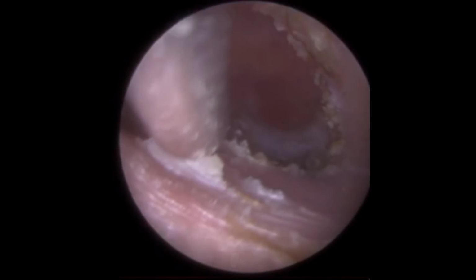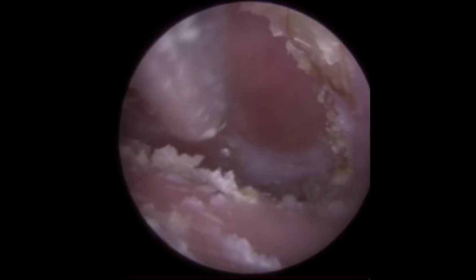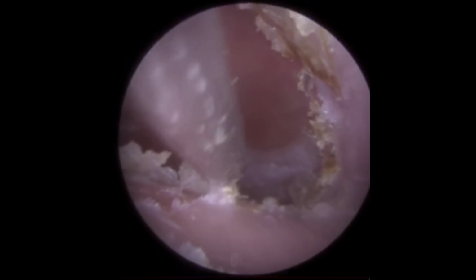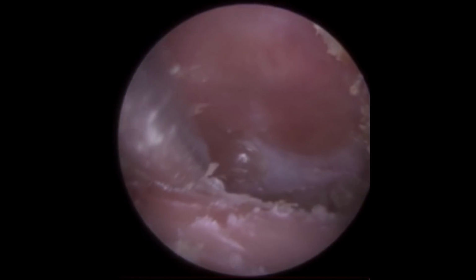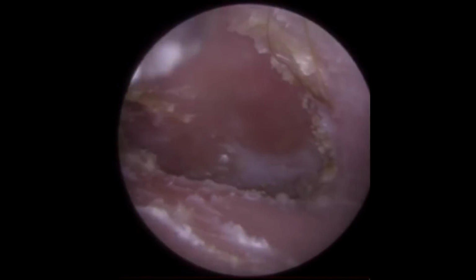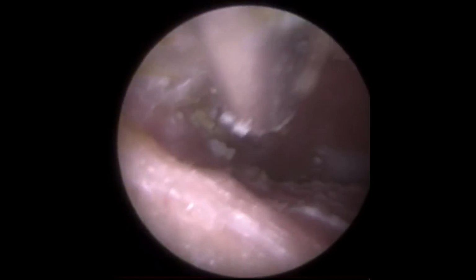So tympanometry is a middle ear assessment test. We play a sound and we change the air pressure in your ear, and we assess how well your eardrum is vibrating by measuring how much of that sound that we amplified in your ear bounces back off the eardrum. This tympanometer also has a microphone attached, and it can measure how much sound is reflected back from the eardrum. The more sound that is reflected back from the eardrum means less sound is being transmitted through the eardrum, meaning that they've got a problem with the middle ear.